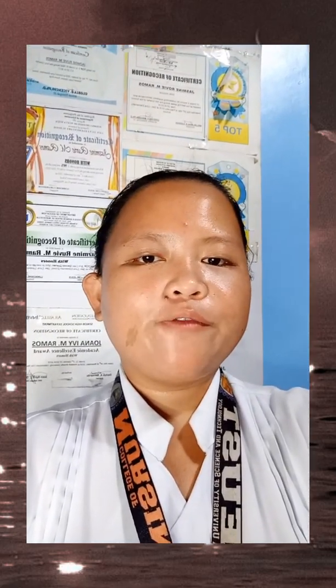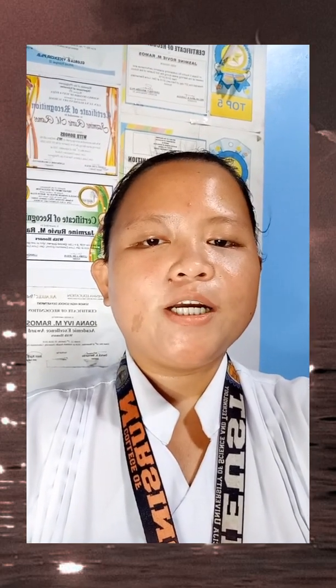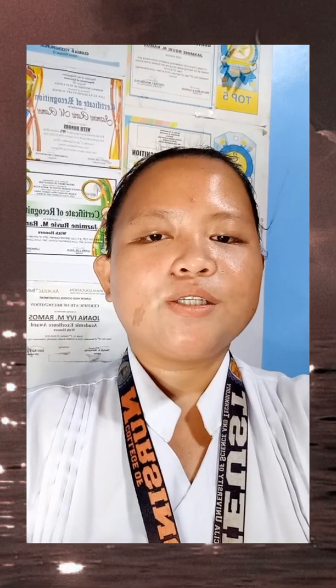And documentation. First, notify the primary care provider for the catheterization results. Next one, perform detailed follow-up based on findings that deviated from expected or normal for the client. Relate the findings to the previous assessment data if available. Teach the client how to care for the indwelling catheter, to drink more fluids, and provide other appropriate instructions.